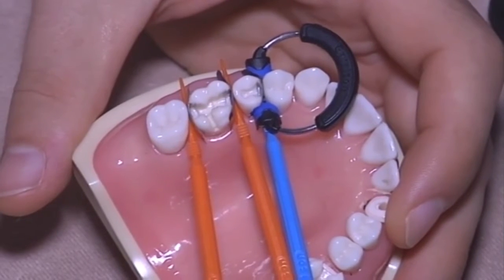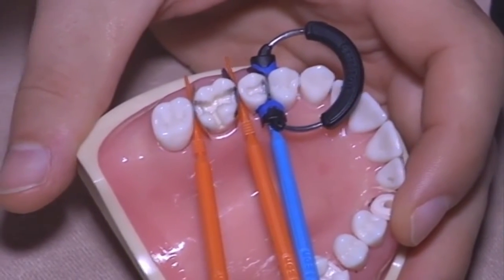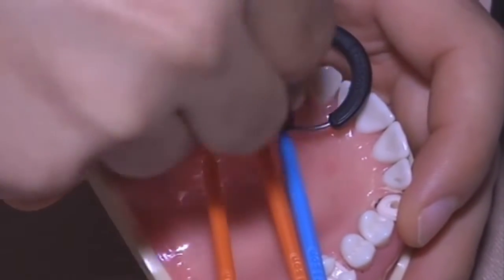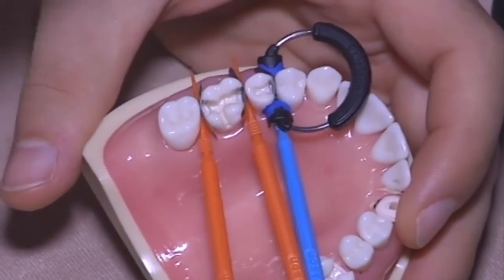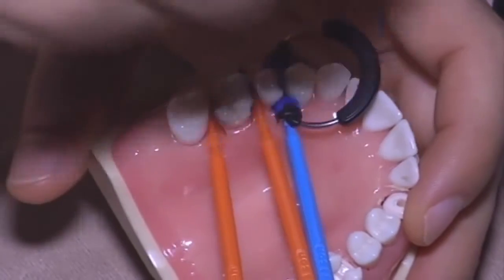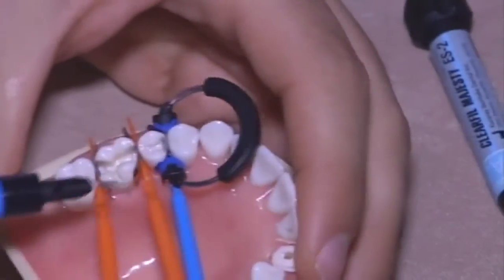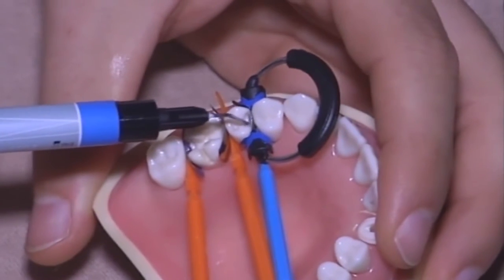cavity walls become stickier than the spatula, and so the composite stays where you want to place it inside the cavity and does not come back with your spatula. Okay, you just need to place a little quantity.